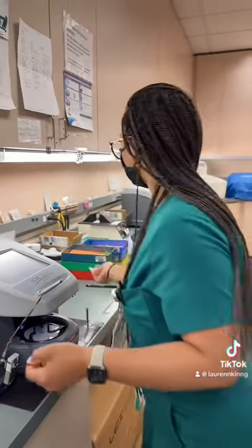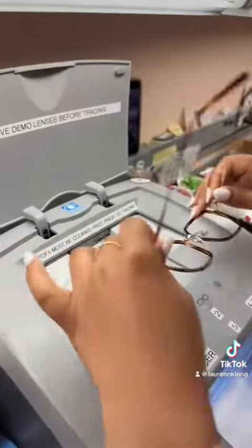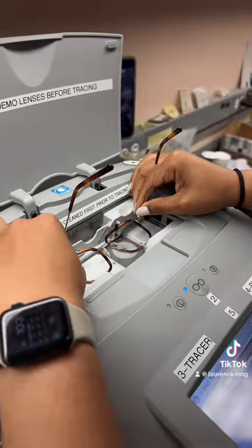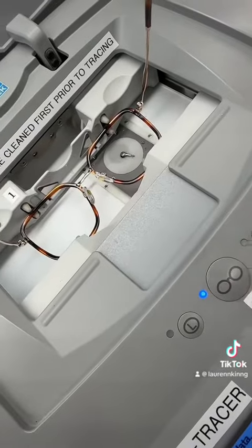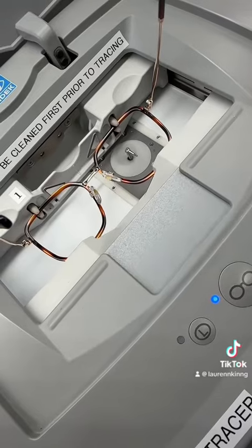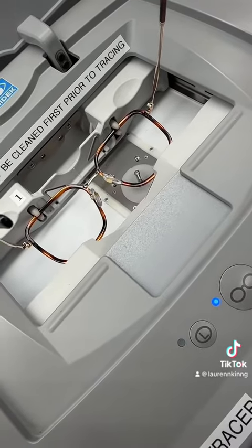Next, we pop the lenses out and recycle those into the plastics to prepare them for the tracer. We then place the frame into the tracer and allow the tracer to trace the frame completely. This will allow the edger and the blocker to know the exact size that the lens should be to fit into the frame.